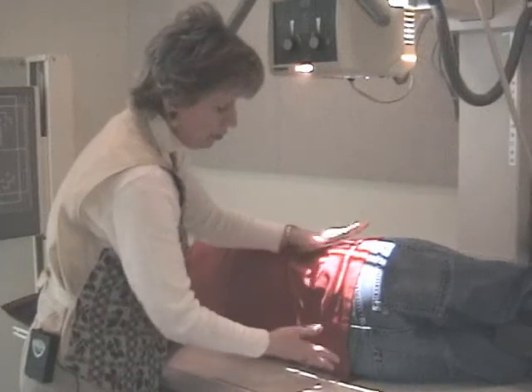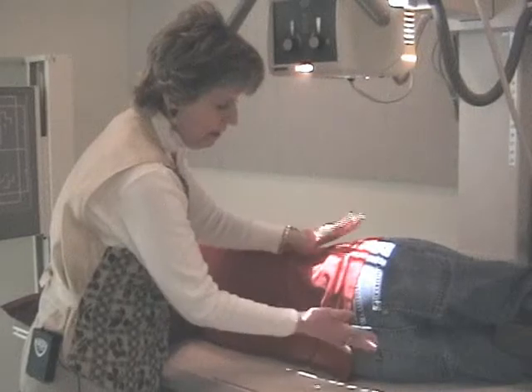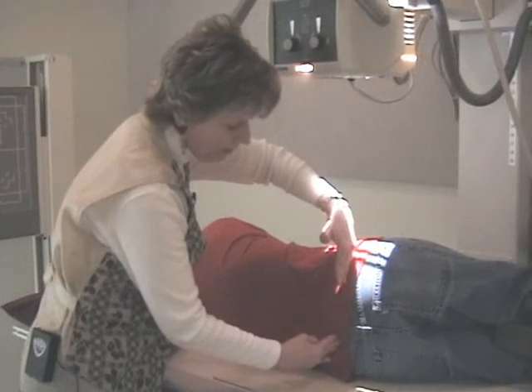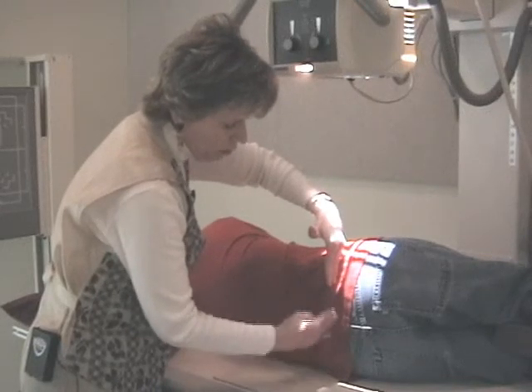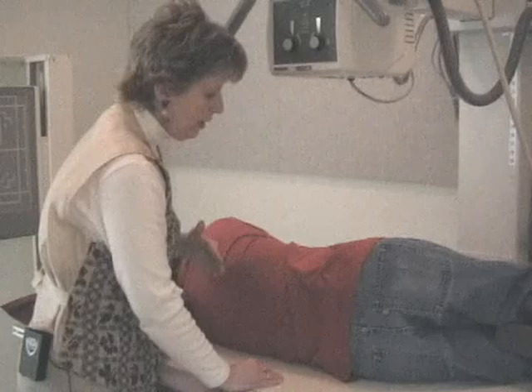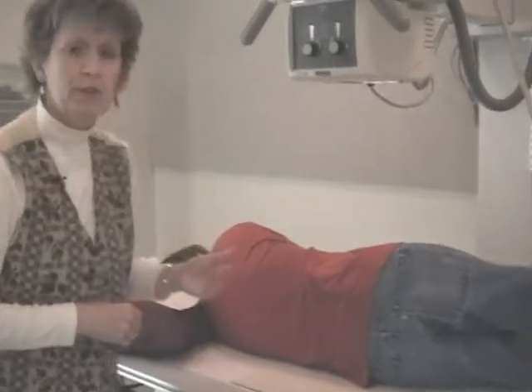Now, any patient that goes into a lateral position, the pelvis tips. Women will tip more than men. So the acetabulum in this level, you would think that they would be in the same vertical plane, but because the pelvis shifts, one will naturally be higher than the other. So we're not concerned if they're not aligned vertically. We are concerned if one is forward as compared to back. Make sure all anatomy is on there, and most of the time, one exposure for a sacrum and a coccyx lateral position will give you good density for both the sacrum and the coccyx.